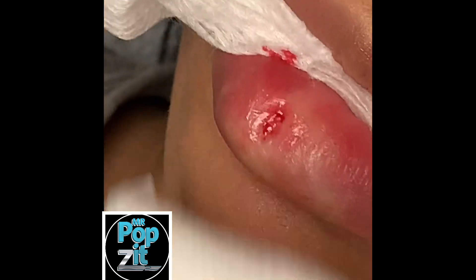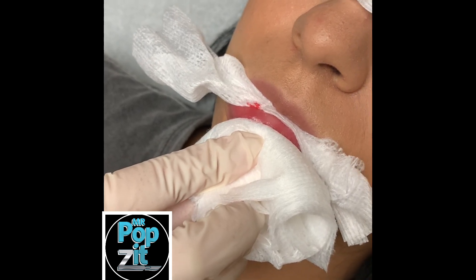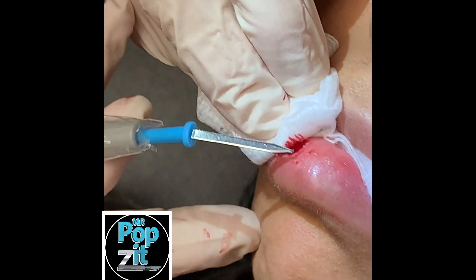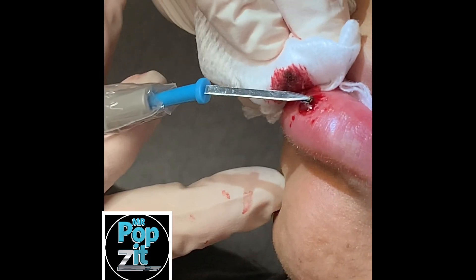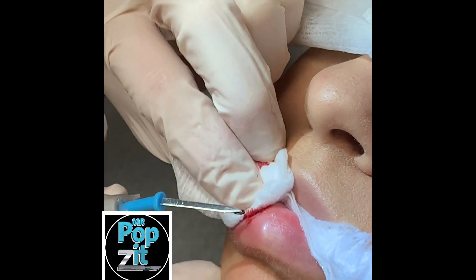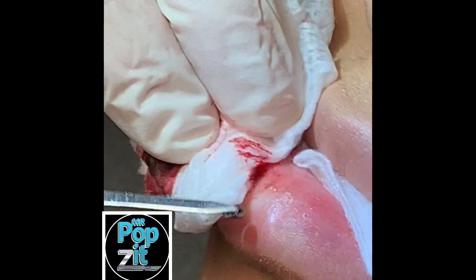Put a little pressure there. This is going to smell a little funny — it's just a little cautery to stop the bleeding for you. Here we go. You can see that one little vessel right in the middle right there. You can turn it up to 30. It's going to look like a decent scab for the short term, but the lip heals very well.